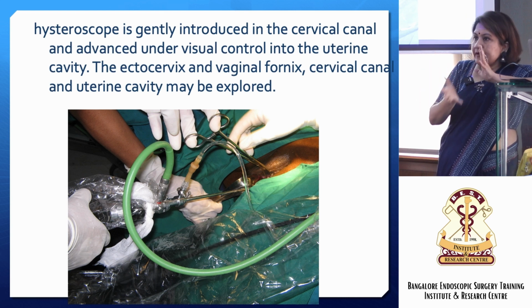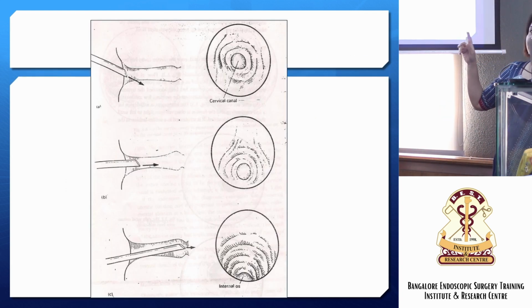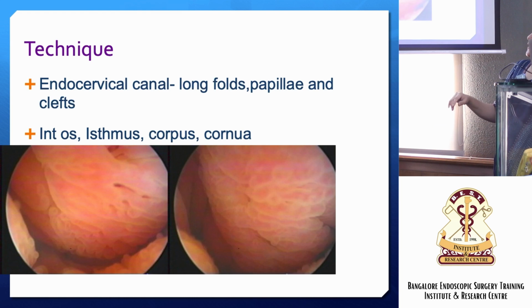Wait for some time, wait for the cervical canal to distend, and then go in. So, I have run through this already with you before. Basically, this is what you need to know, and this is how it will practically appear.